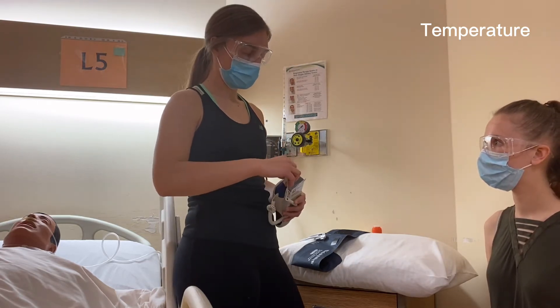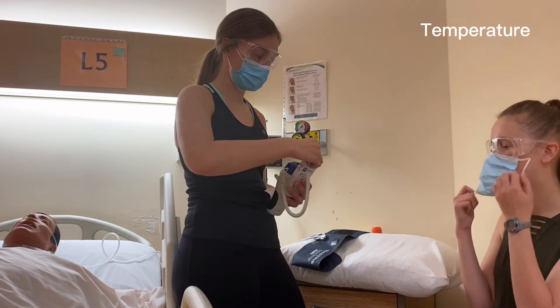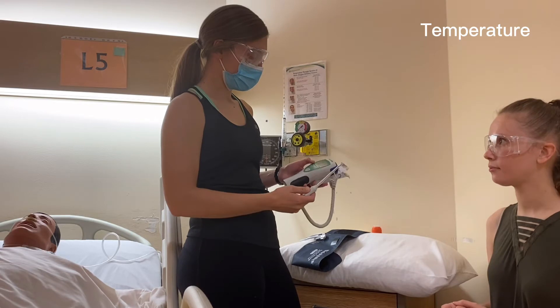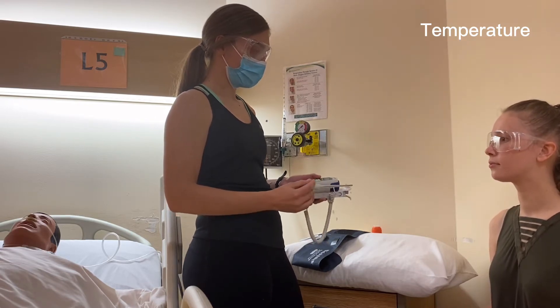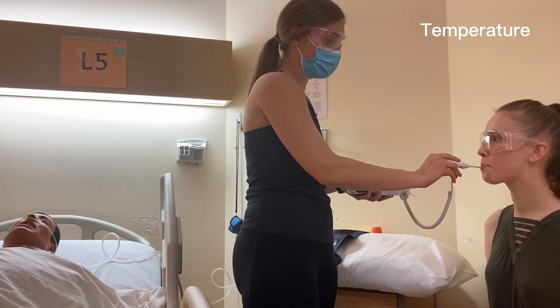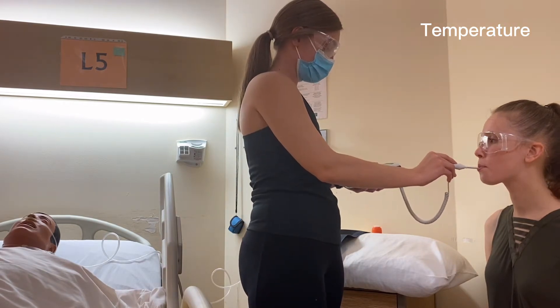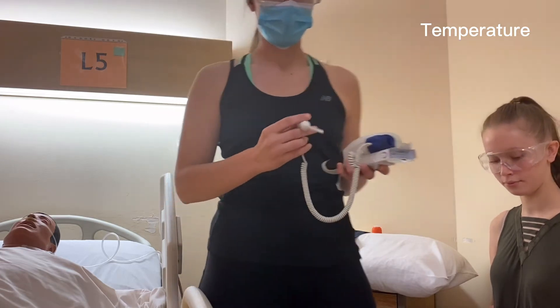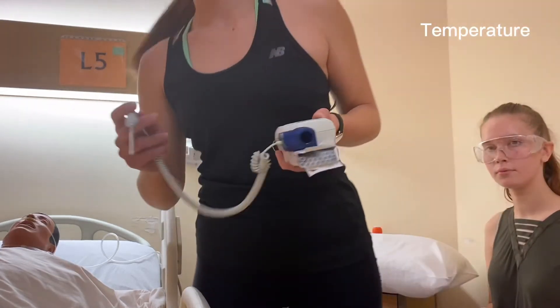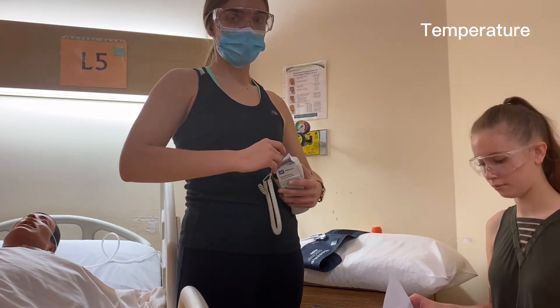We'll start by removing the probe cover, sticking on a new sheath, and making sure that's on tightly. We want to make sure it's set to oral, and we're going to do it in degrees Celsius. We ask the patient to open their mouth and insert it under their tongue. We ask the patient to close their mouth — they can hold it or you can hold it — and then we wait until we hear a beep. It's at 37 degrees Celsius. We eject the sheath, noting on our chart that the temperature was 37 degrees Celsius and the route was oral.